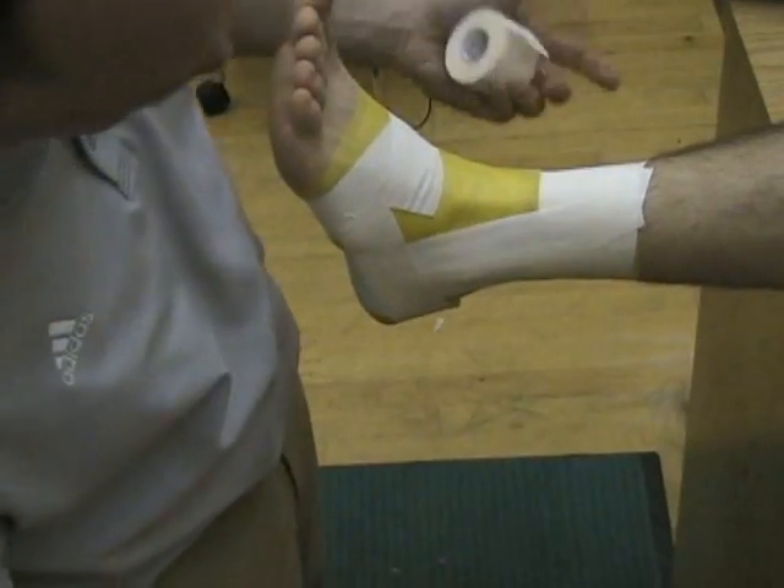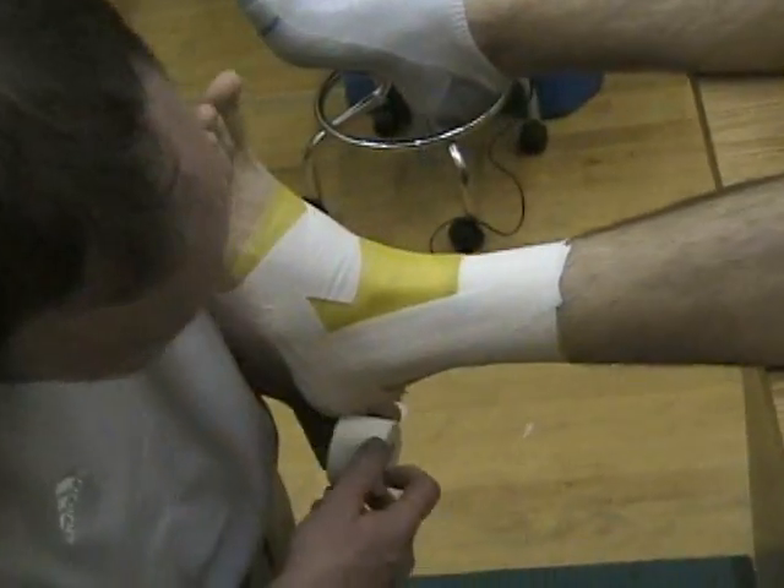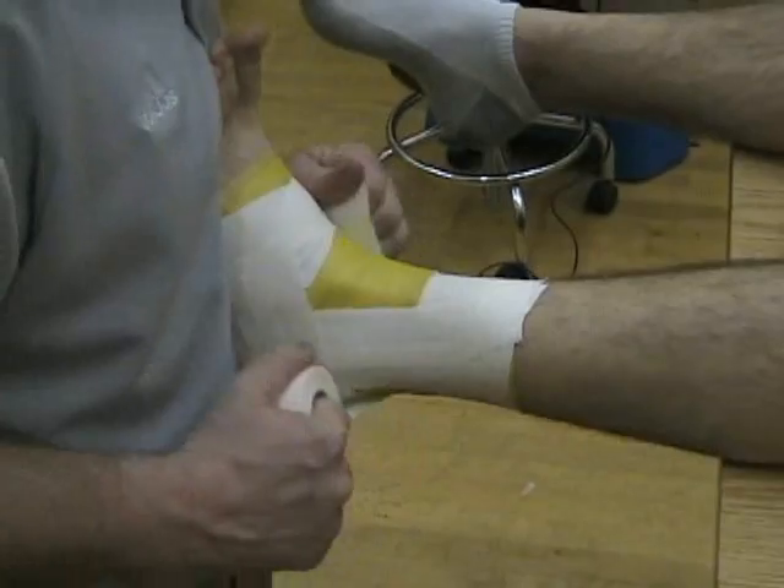The horseshoes can go medial to lateral or lateral to medial — it doesn't matter. They start at the base of the foot; make sure you get down towards the heel, not up into the Achilles tendon. These again overlap by about half, and we're going to apply three of those.